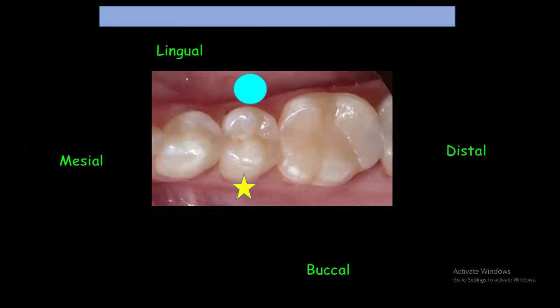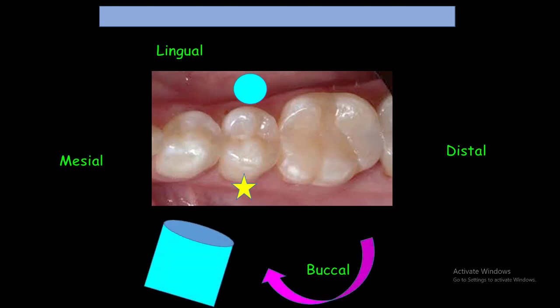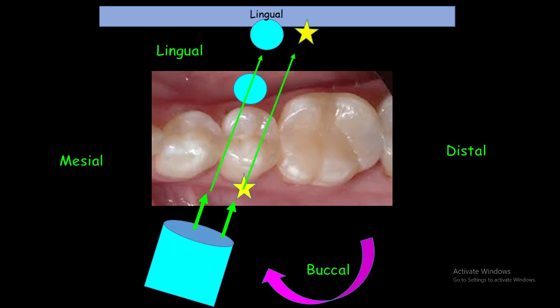If we take another radiograph with a different angle, like with a tube shift towards the mesial, the objects in the lingual move mesially and the objects in the buccal move distally. This is the meaning of the SLOB technique — Same Lingual, Opposite Buccal. The object that moves in the same direction as the tube is positioned lingually, so the object imaged on the mesial is positioned in the lingual.